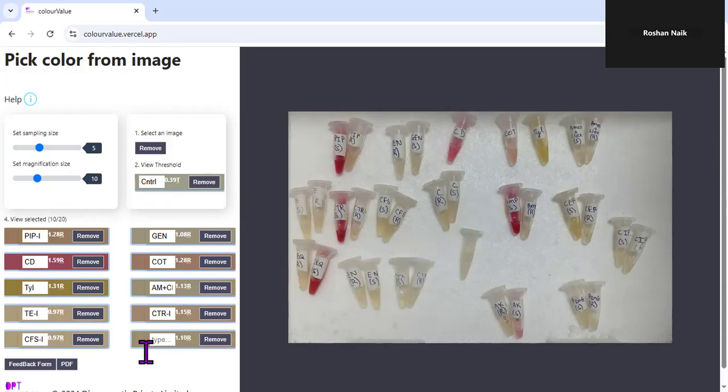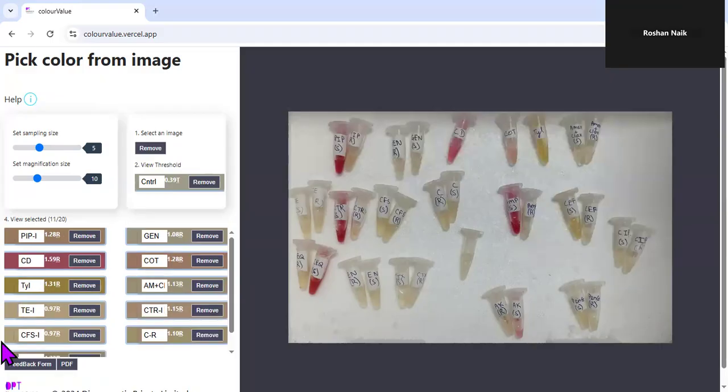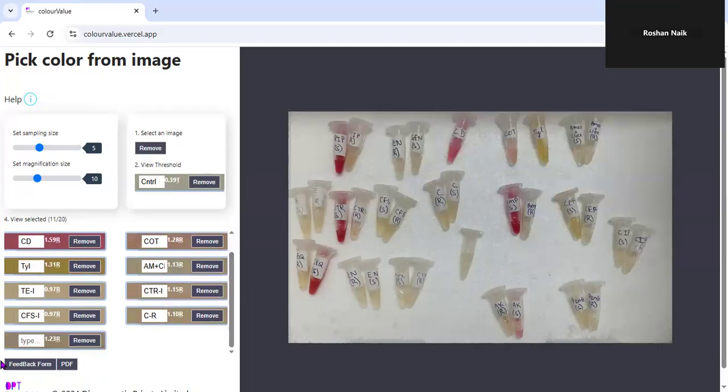Then ciprofloxacin. This is resistant. Ampicillin: you can see dark color in the susceptible tube, but when you increase the concentration in the resistant tube, it drops. So again it is an intermediate phenotype. That's why I clicked on the next one, AMP. Intermediate.